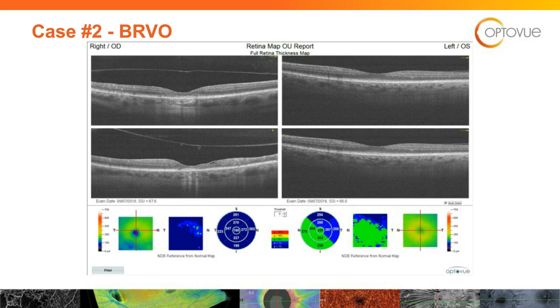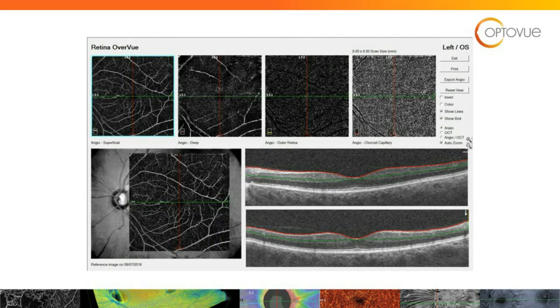There is no edema in the left eye, but take a look at this left eye. Again, this is the non-vein occlusion eye, and once again those 2 scans on the left don't look very good. Capillary dropout, areas of non-perfusion. This was before we had analytics, but if we were measuring the vessel density on these 2 on the left, which we'll go through in just a second, those numbers would be very, very low in this case.